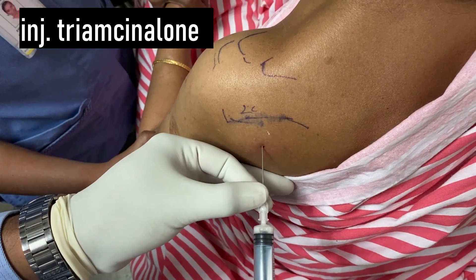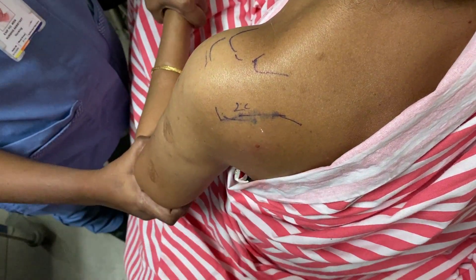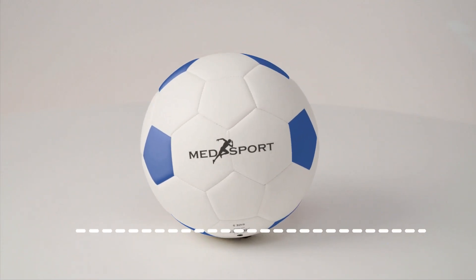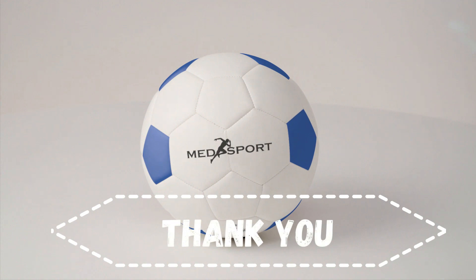Then the joint is injected with cortisone — triamcinolone alone in this case. Joint injections, in my opinion, should be the first step in the management of frozen shoulder. It avoids countless hours of painful therapy, is cost effective, and it can save thousands in unnecessary treatment modalities. Thank you very much.